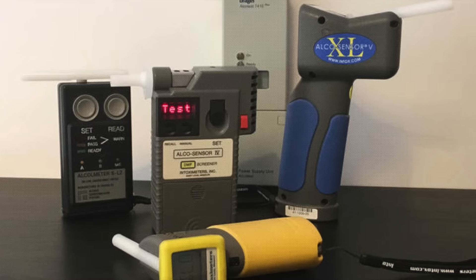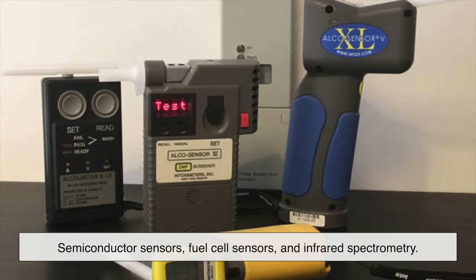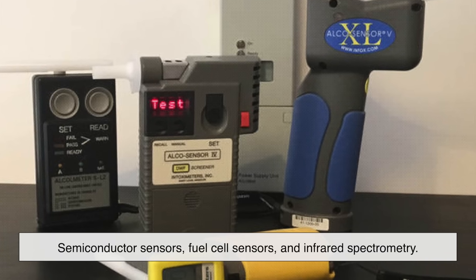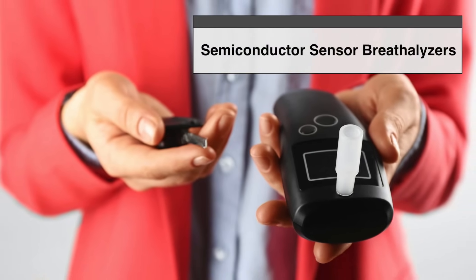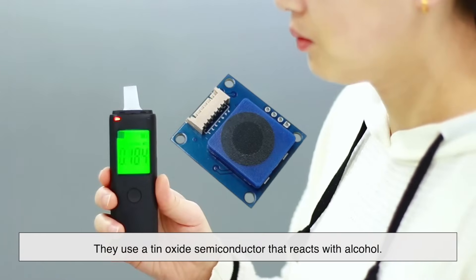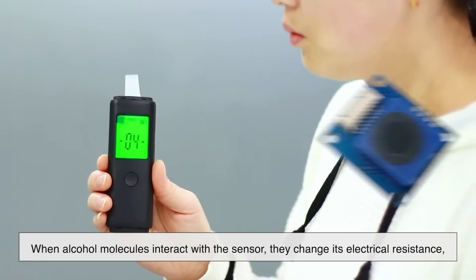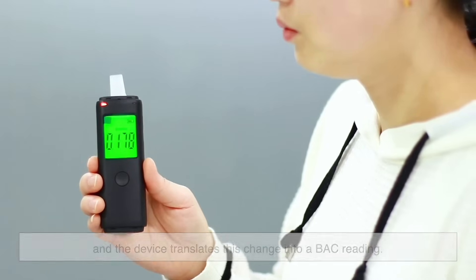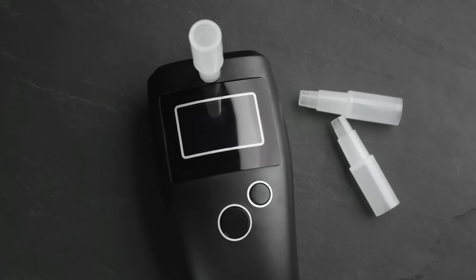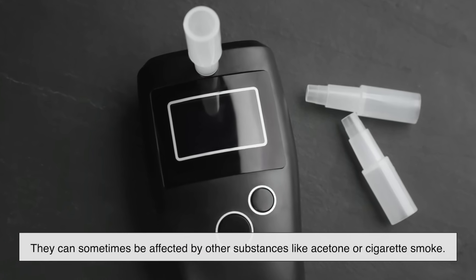There are three main types of breathalyzers, each using different technology to measure alcohol levels: semiconductor sensors, fuel cell sensors, and infrared spectrometry. Semiconductor sensor breathalyzers are the cheapest and most common, often found in personal breath testers. They use a tin oxide semiconductor that reacts with alcohol — when alcohol molecules interact with the sensor, they change its electrical resistance, and the device translates this change into a BAC reading. However, they can be affected by other substances like acetone or cigarette smoke.